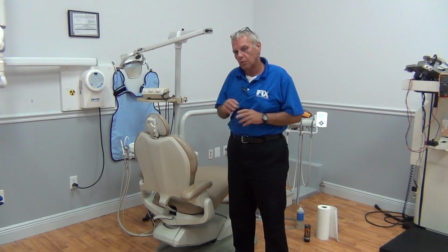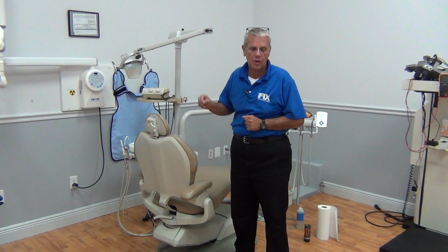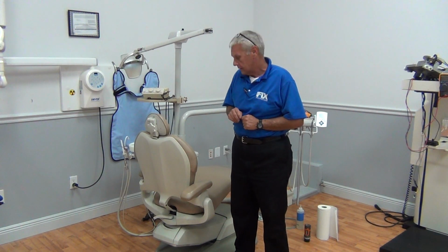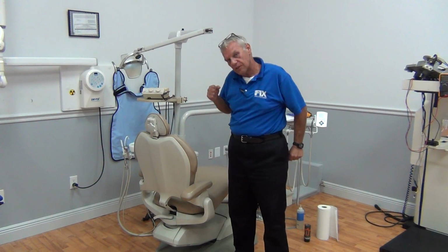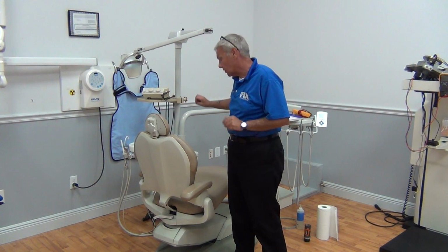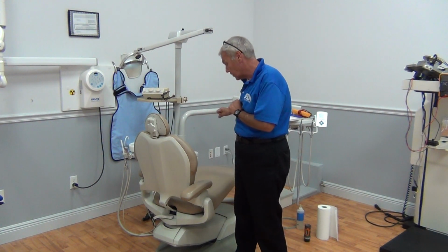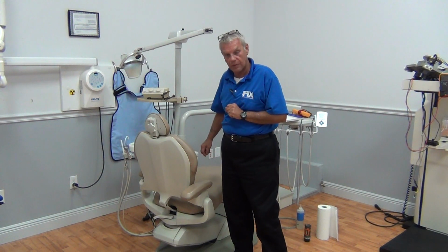Let's remember that we're only discussing the chair. Again, nomenclature is everything. The name you call something is everything. When we say the chair, we mean the chair only where the patient sits. We don't mean the stool. We don't mean the light. We don't mean the cuspidor. We don't mean the delivery system, nor the mount. We mean the chair only, so that's what we're going to be concentrating on.